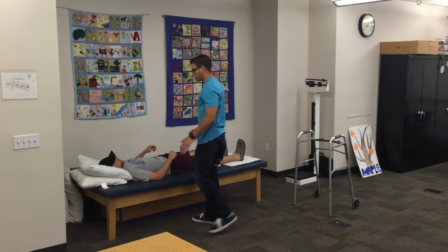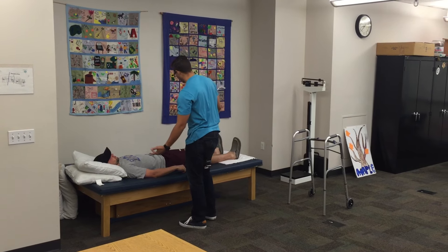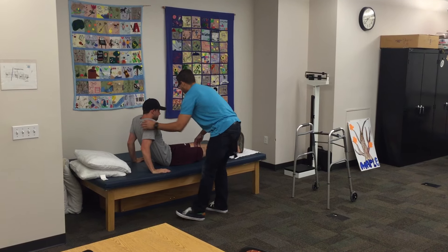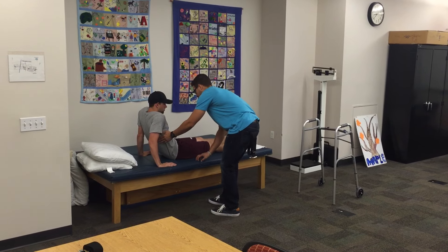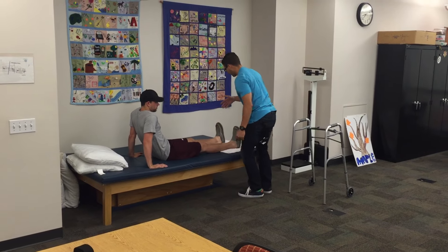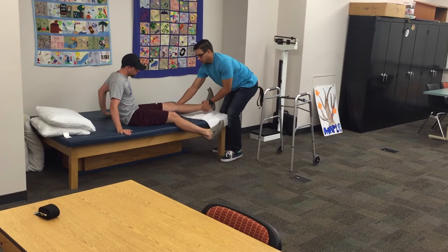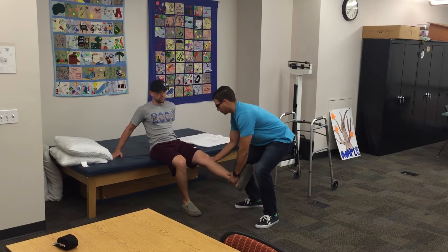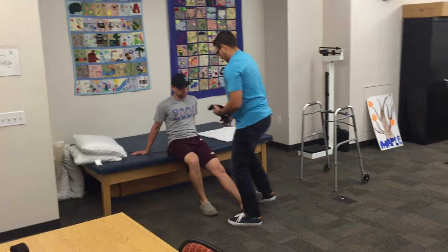So what we're going to do — remember those hip precautions, we can't bring it to the midline. So first we're going to get up on our elbows here real quick. There we go. And what we're going to do is slide here until we're sitting off the edge — I want you pretty close to where your bottom is almost hanging off. I'm going to keep this one behind; I want you to move that one. Let's get that one moving — I'll worry about this one. Push to the edge there. There we go. Sit right there.